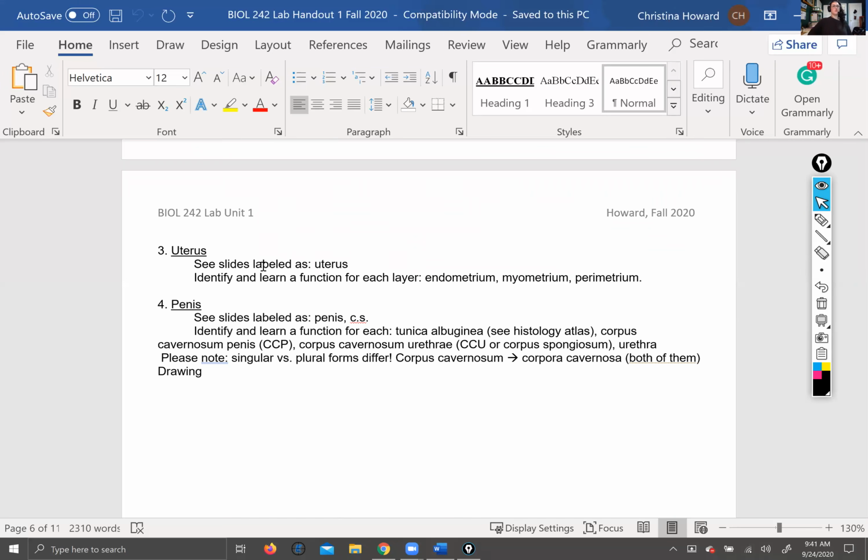Sometimes questions come in 2 parts where I will say, identify the organ in the field of view. And the second portion of the question will say, identify the structure highlighted in yellow. So in that case, you would say first the organ and then the structure.